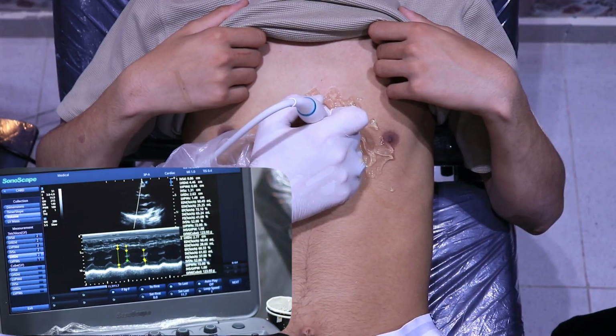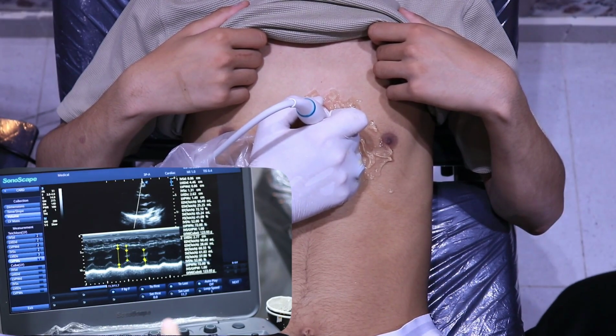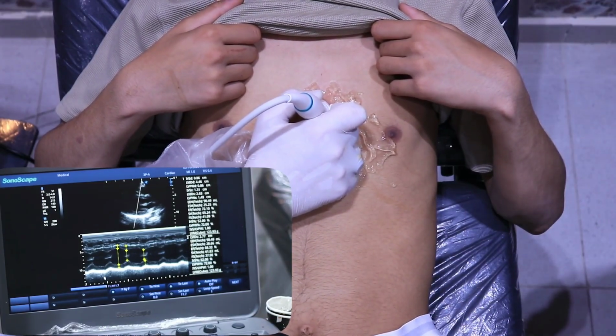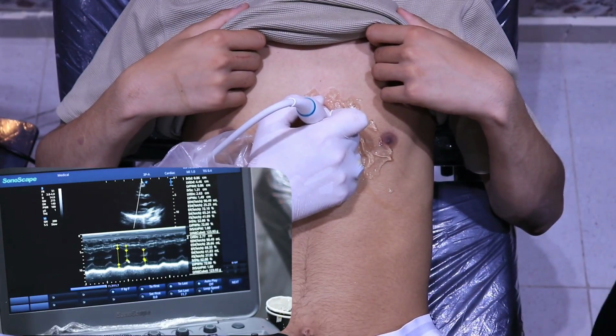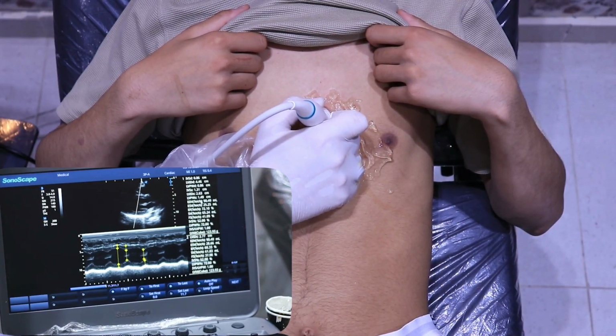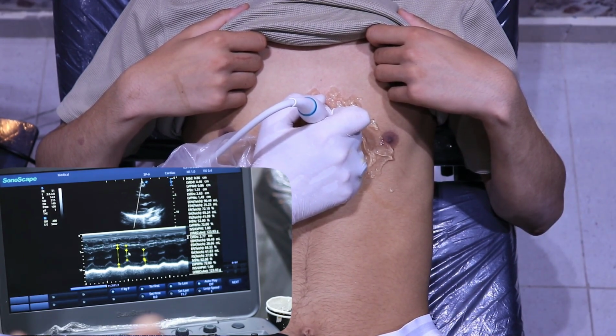اهم حاجه البوينتس تبقى بالظبط مكانها فين. شايف يا دكتور؟ الدكتور كان بيسال عن البوينت، شايف فين البوينت؟ واخدها على نفس اللاين، وهنا برضو على نفس اللاين. تطلع لي الايجكشن فراكشن كام؟ 68. يبقى برضو نفس الايجكشن فراكشن، هنا كانت 72 بقت 68. يبقى احنا بنتراوح في نفس الرينج.